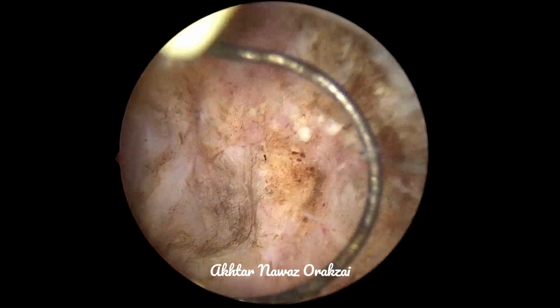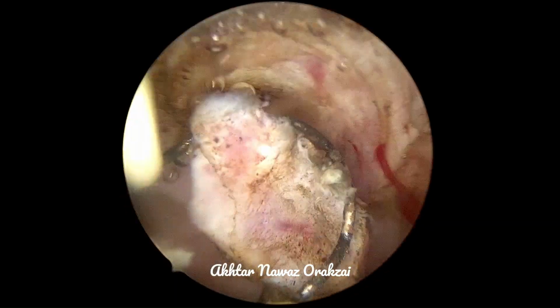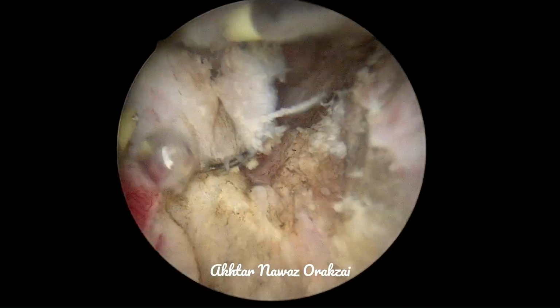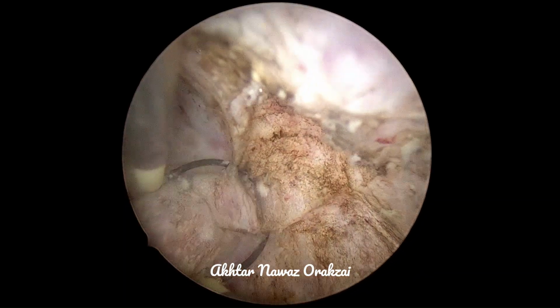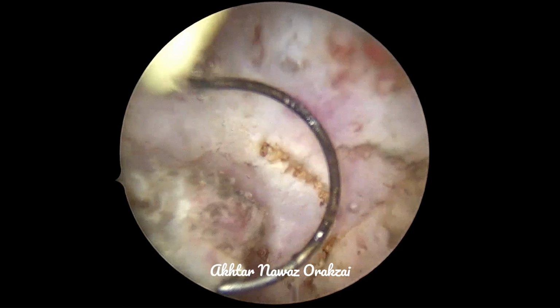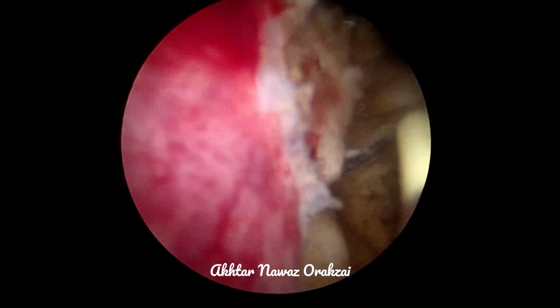And the second good thing was that after use of combination therapy for 4 weeks, the prostate size on follow-up was 85 grams instead of 115 grams. You can see a small breach in the capsule of the prostate, because I was expecting a bigger prostate. That's why I was resecting very boldly deep into the prostatic parenchyma, which has led to the breach in the capsule at a small location. However, we are lucky that we were not deep enough.